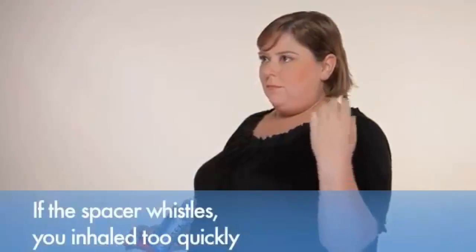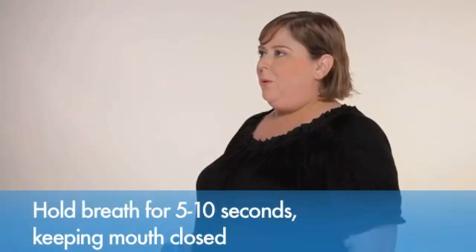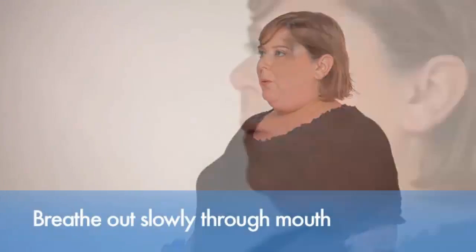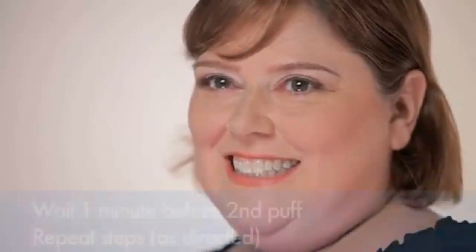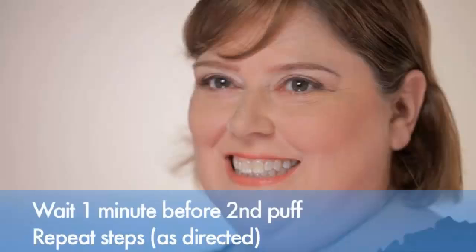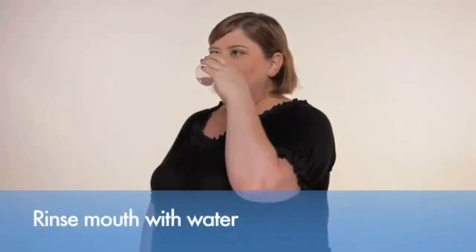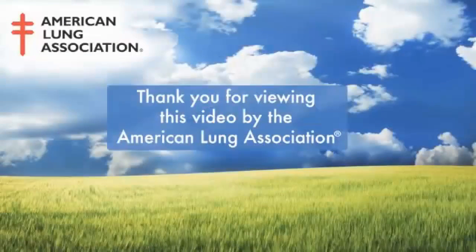Breathe in deeply and slowly for about five seconds to pull the medicine deep into your lungs. If the spacer makes a whistling sound, you inhaled too quickly. Hold your breath for five to ten seconds or as long as you comfortably can with your mouth closed. Breathe out slowly through your mouth. If you breathe out too quickly, the medicine will not settle into your lungs. Wait one minute before taking a second puff as directed by your health care provider. Repeat these steps if taking a second puff. Rinse your mouth out with water and spit.